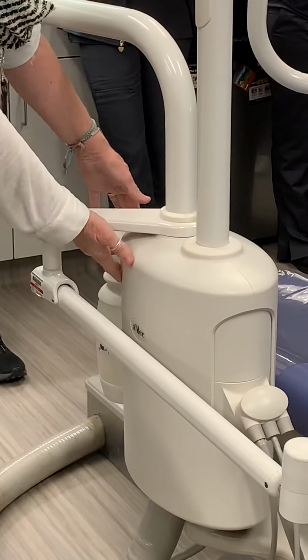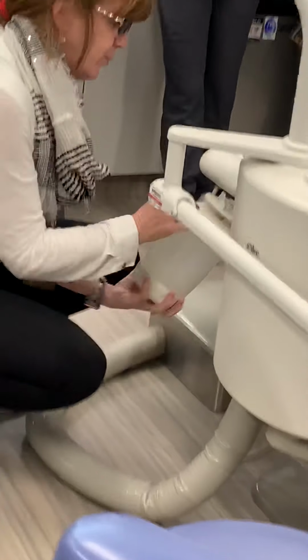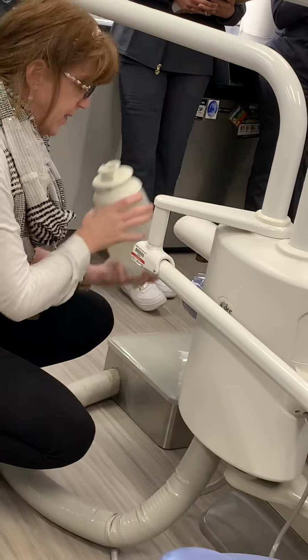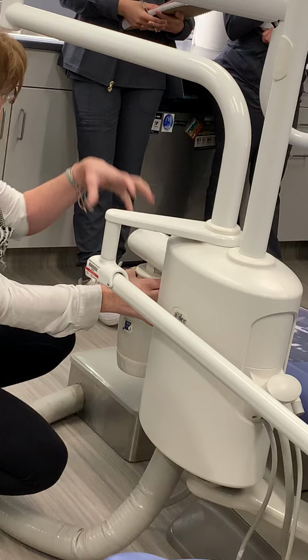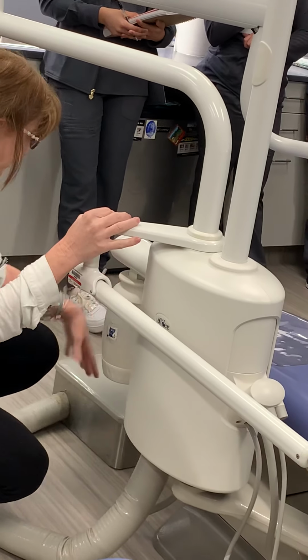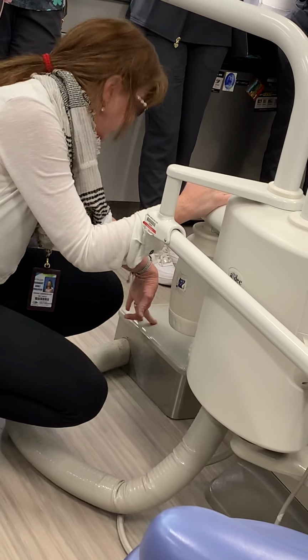This is the water delivery system. We use distilled water with an ADAC tablet, where they're empty right now. We'll fill them up as we get ready to use them, and then it keeps the water clean and fresh for the patient, so it's not sitting stagnant in the hoses. You don't have to say that, you just have to, okay? This is a power or supply box. If it's not working, who do you call?